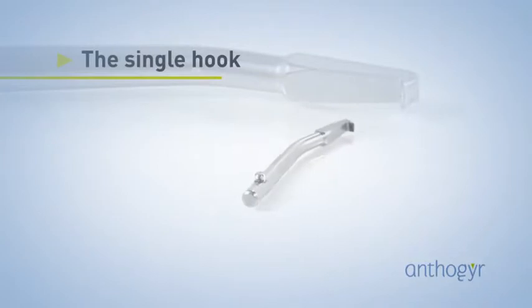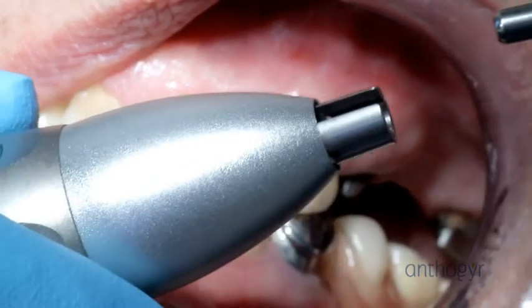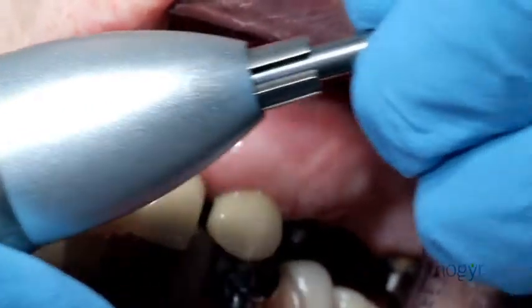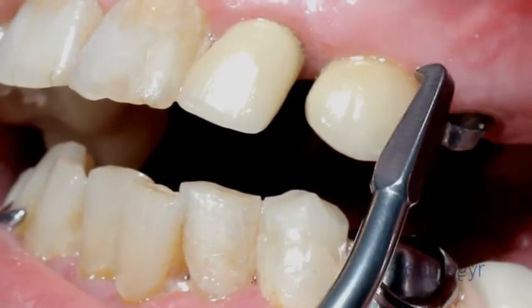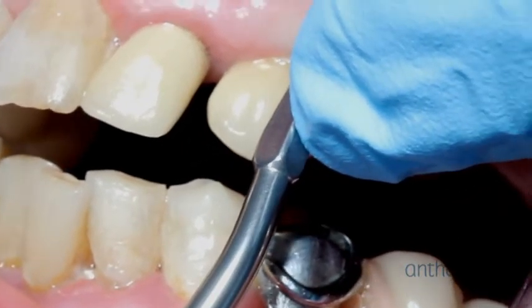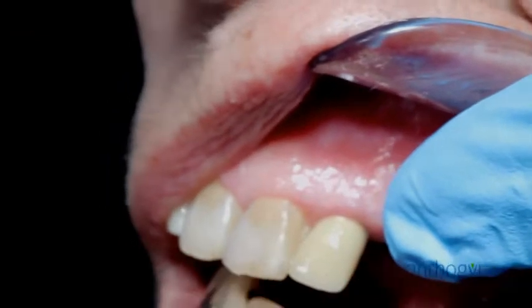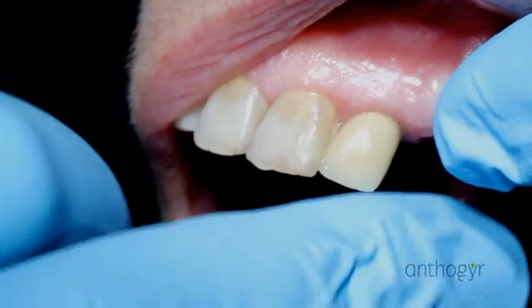An anterior crown is to be removed by using the single hook. Single hook is placed under the ridge of the gum and aligned along the vestibular side of the crown. Apply pressure on the tooth to feel the microstrokes and, if necessary, adapt the intensity adjustment ring if the crown withstands the stress. You'll notice the speed at which the crown's loosened once SafeRelax is activated. In this case, simultaneous loosening of the inlay core can be noted.